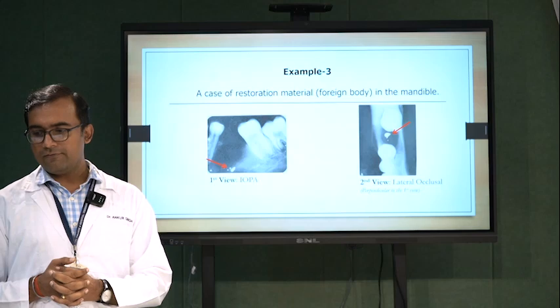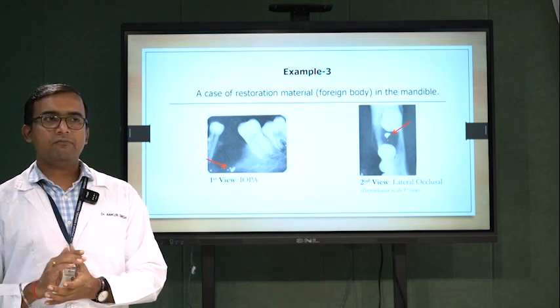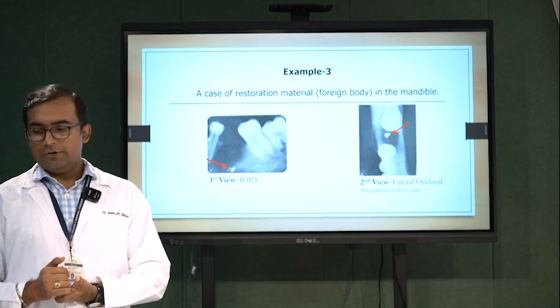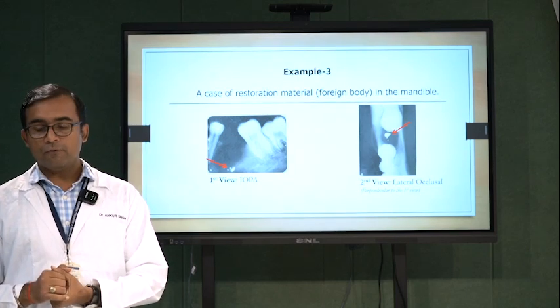Third example is of a dental restoration which somehow got impinged into the tissue. So here is a case of the fourth quadrant.